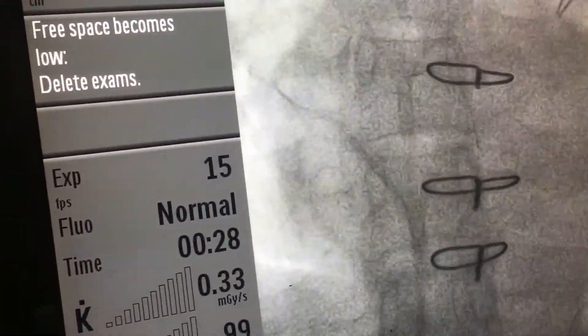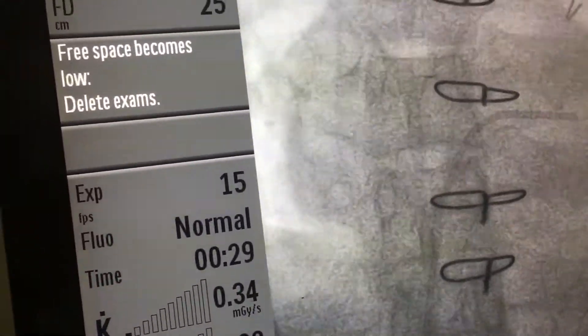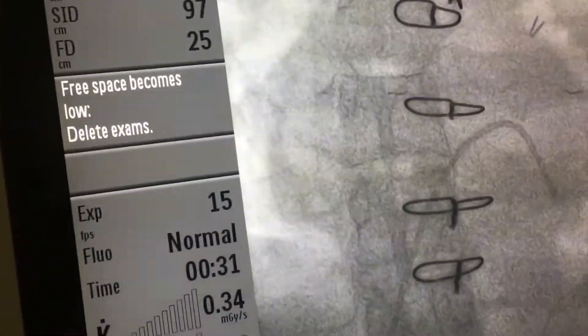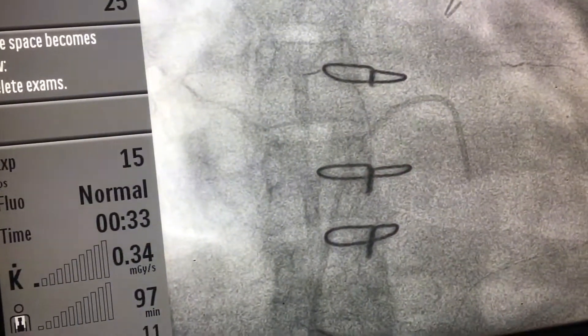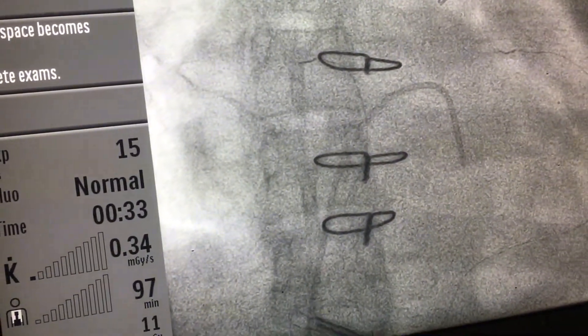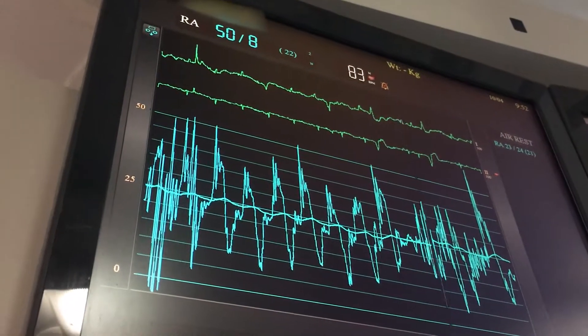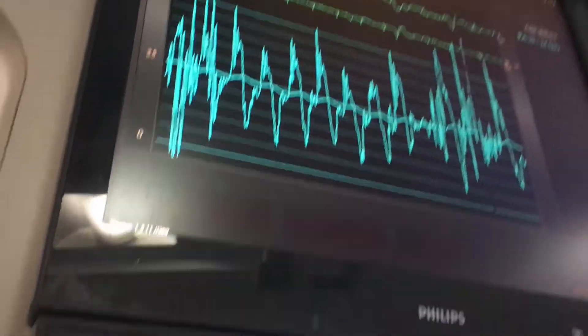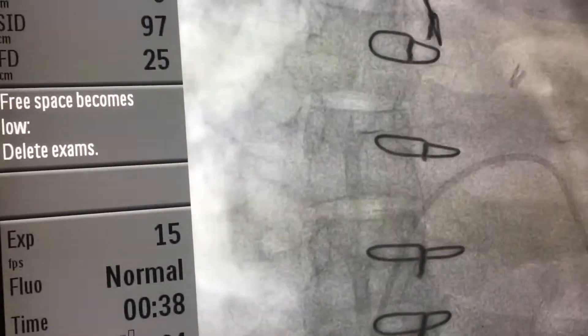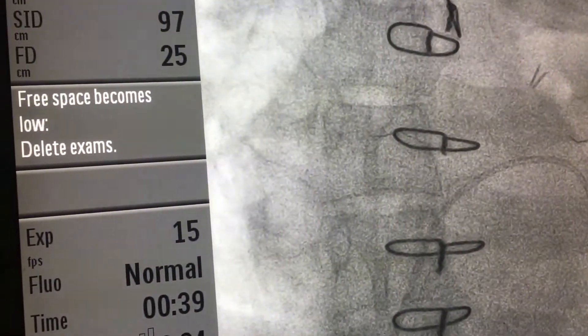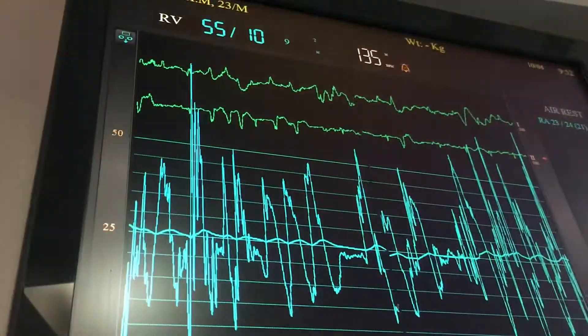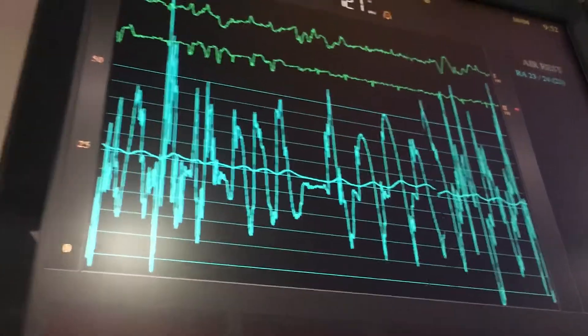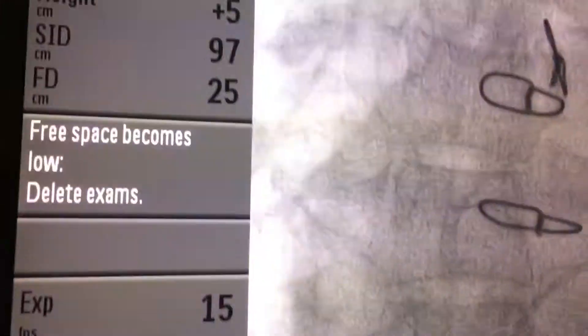Yeah, so we are in the RV. You are seeing ectopics. I am in the RV. Yeah, I am in the RV now. Yeah, so this position, now we are in the RV.